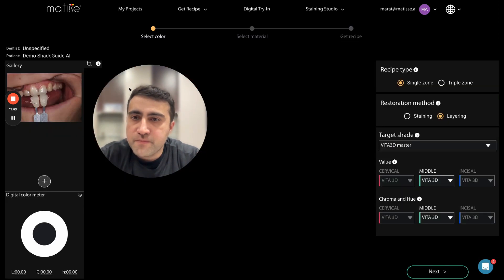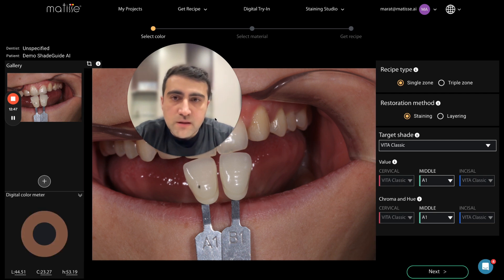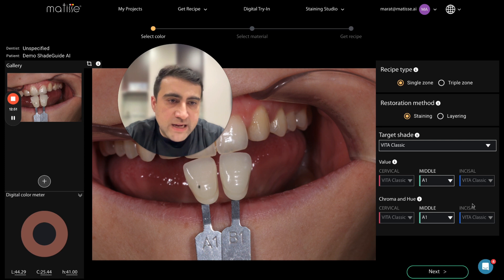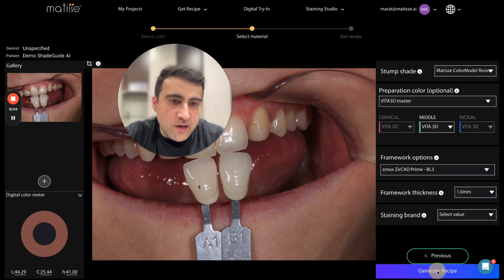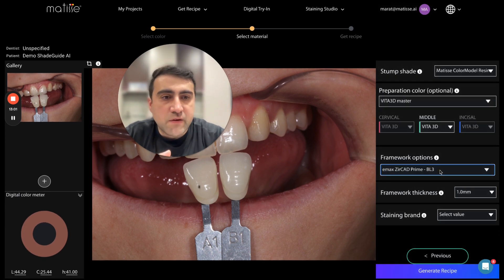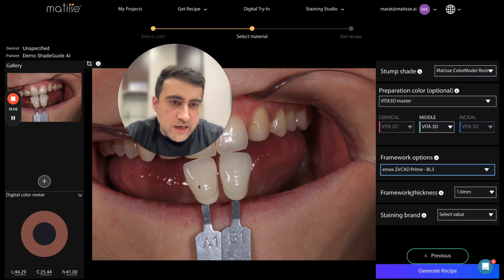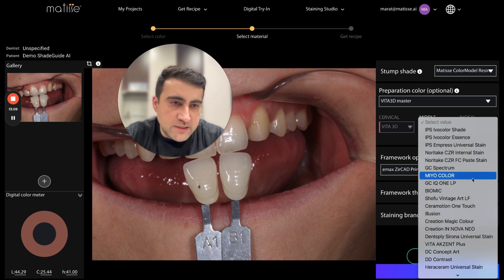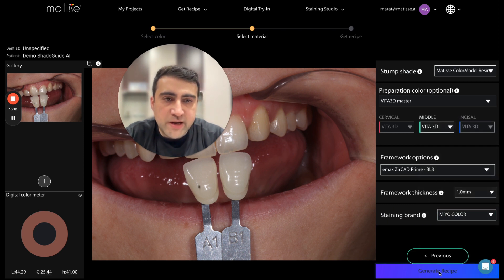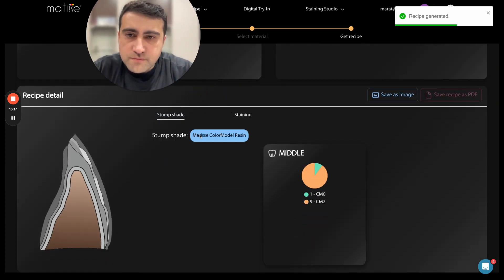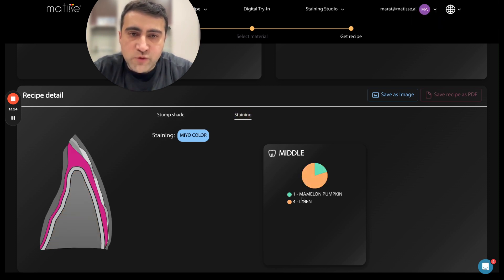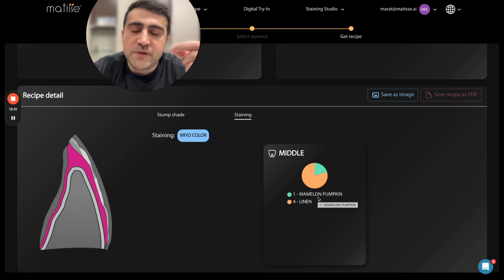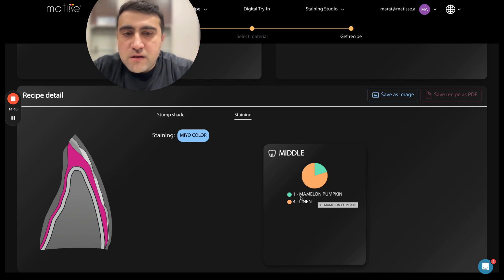Now the staining recipe: select staining, value A1, chroma A1, stump shade Color Model Resin Preparation. When using monolithic crowns, always start one or two shades brighter. Enter the thickness of the crown and the staining brand — let's use MIO for example — and generate the recipe. The staining mix is Mamelon Pumpkin one time and Linen four times. For paste stains, we developed a silicone portioner to mix the given ratios.